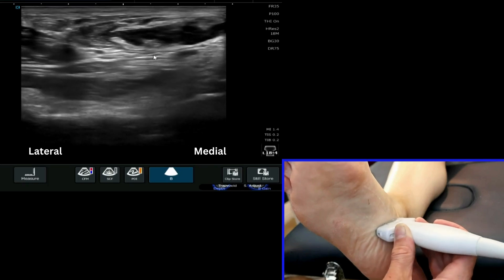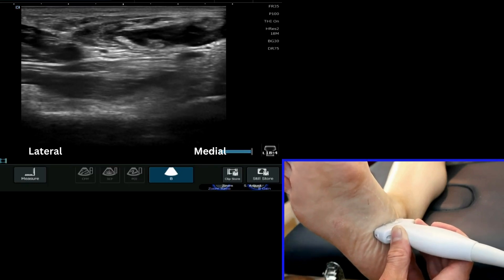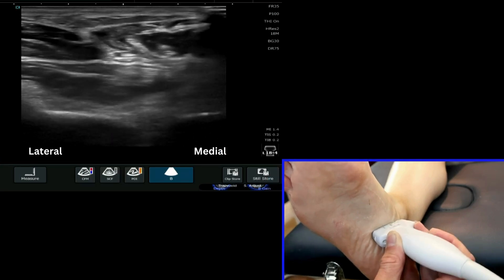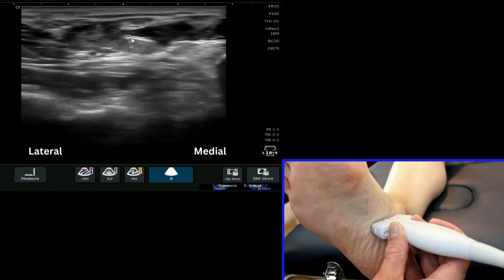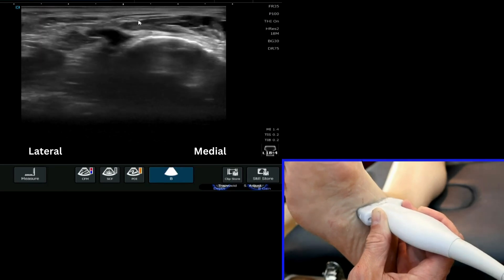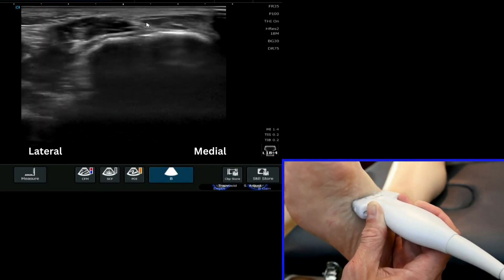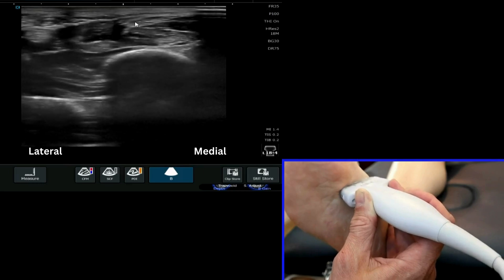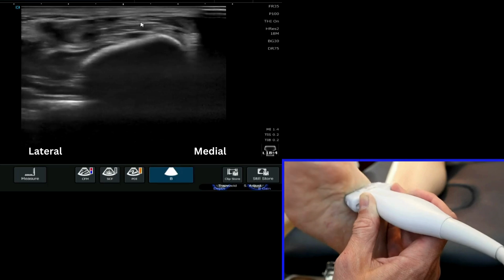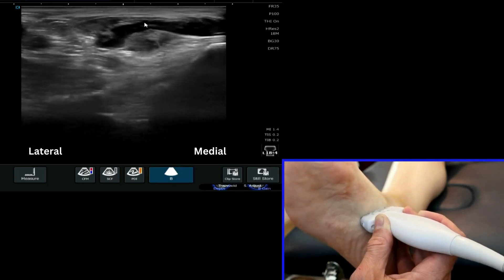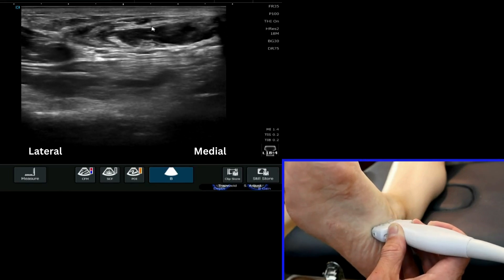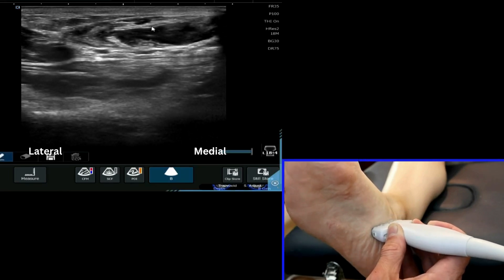If we then bring the probe around a little bit further medial, we'll start to see the muscle belly here of abductor hallucis. You can follow that down distally to see it start to form a central tendon at this point, adjacent to my cursor. If I get the patient to wiggle their big toe at that point, we'll see that move around a little bit, and as we come back up we start to see it form back into that muscle.